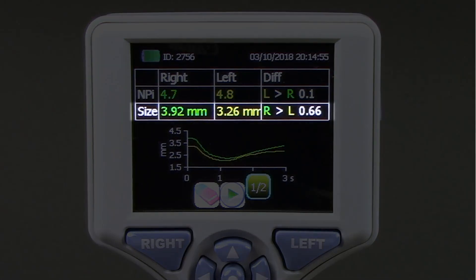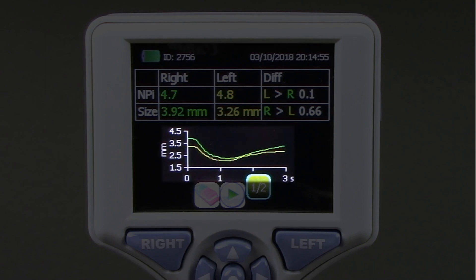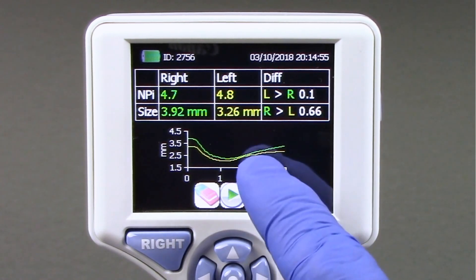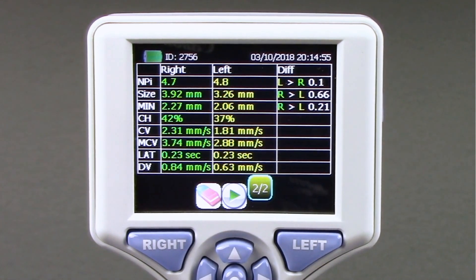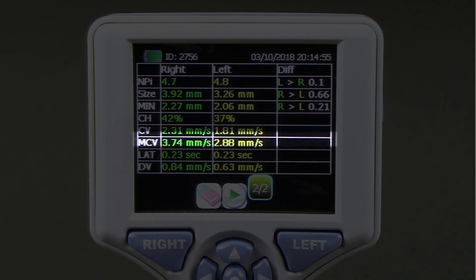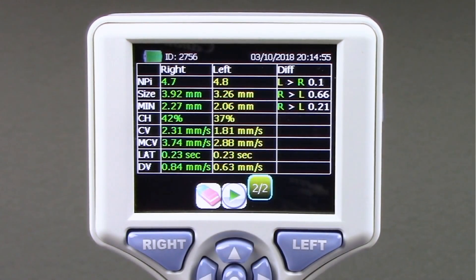Pupil size is displayed to the hundredths. The Pupillary Light Reflex Waveform, or PLR, is displayed for both the left and right pupils. By pressing the 1-2 button at the bottom of the screen, you can advance to Results Page 2, which shows additional measurements including Minimum Pupil Diameter, Change in Pupil Size, Constriction Velocity, Maximum Constriction Velocity, Latency, and Dilation Velocity.